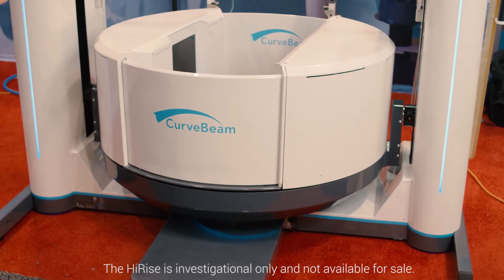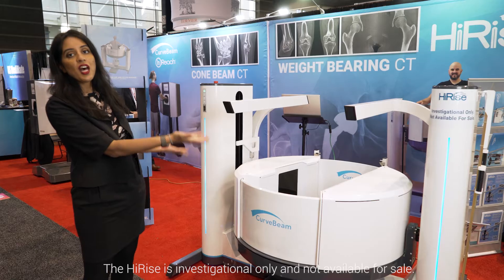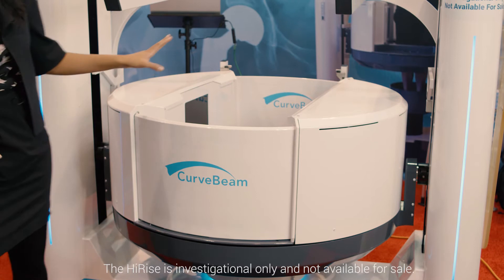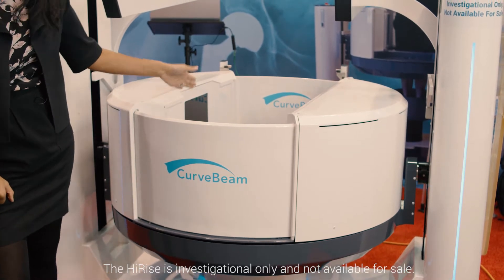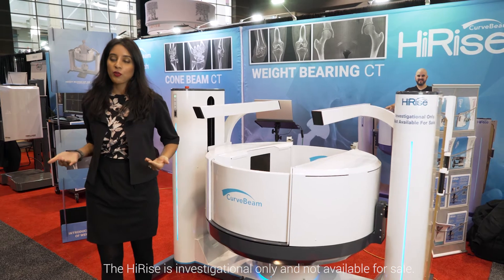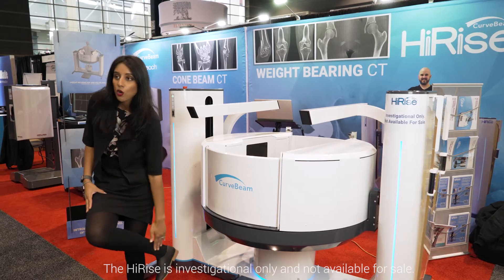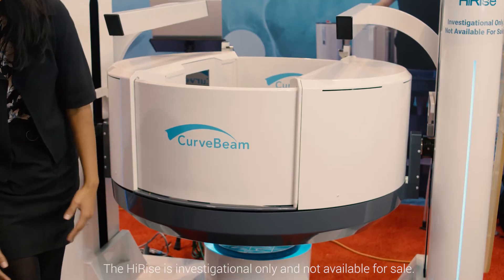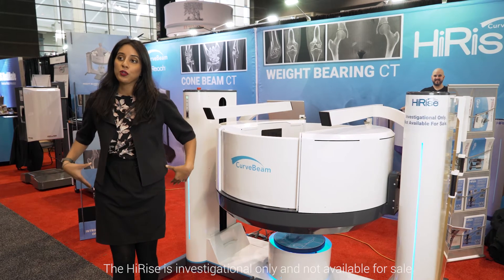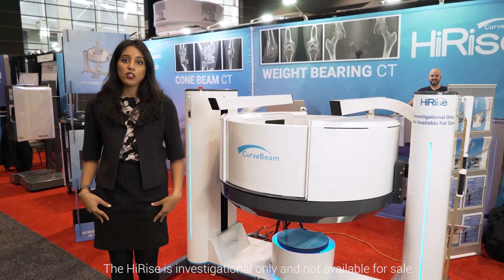The high-rise gantry is attached to two columns and it moves up and down those two column supports. The patient stands inside on the platform and the gantry rises up around them to the specified height — whether that's somewhere along the lower leg, the knee, between the knee and the hip, or the actual hip and pelvis. You'll be able to capture any point along the lower limb.